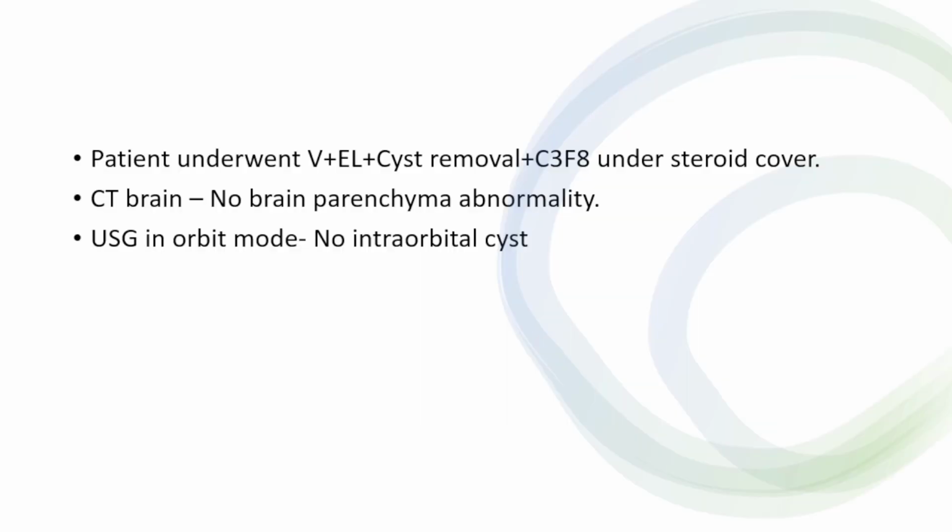So the patient underwent left eye vitrectomy with endolaser along with cyst removal with C3F8 under steroid cover. CT brain was also done to rule out any brain or neurocysticercosis signs. And also the ultrasound was performed in orbit mode to rule out intraorbital cyst or intramuscular cysticercosis as well.